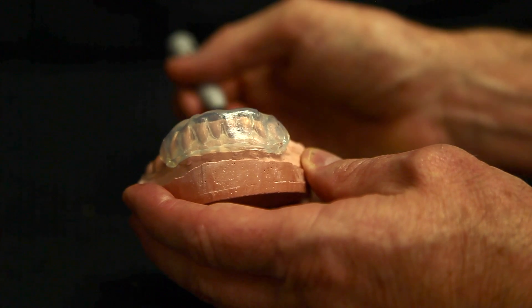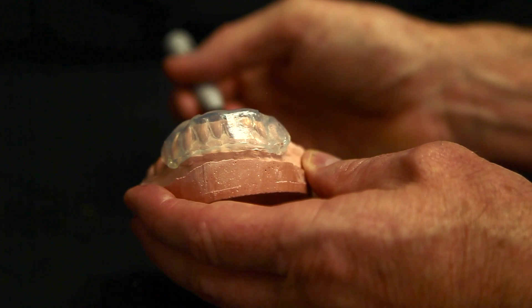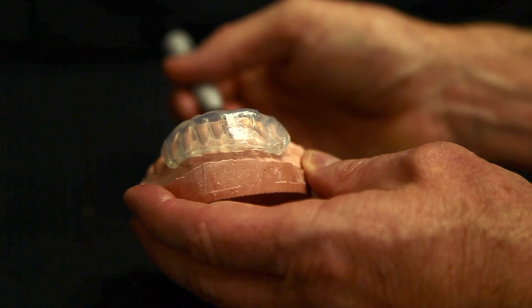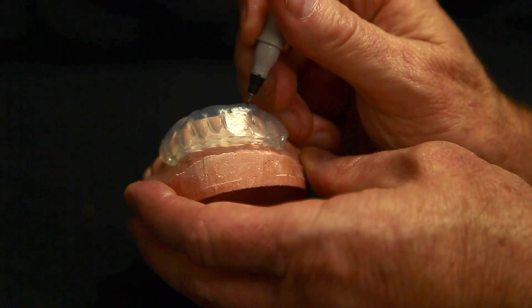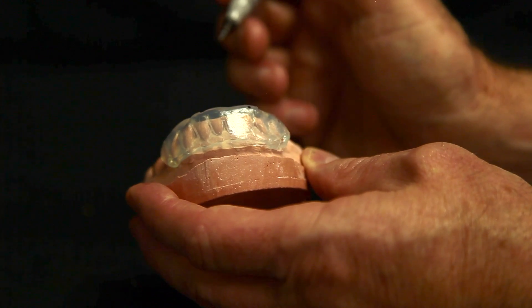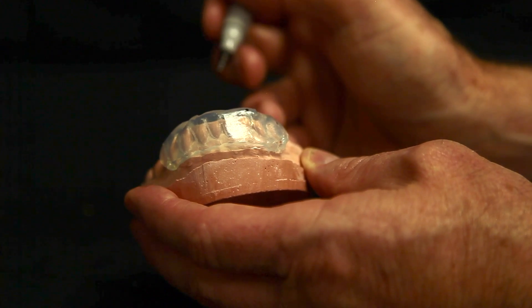Don't put them right on the incisal edge. You spend a lot of time putting the proper anatomy on there, getting all the proper occlusal stops there. You want to come down just a little bit off the incisal edge if there's a large facial addition, which usually there is.